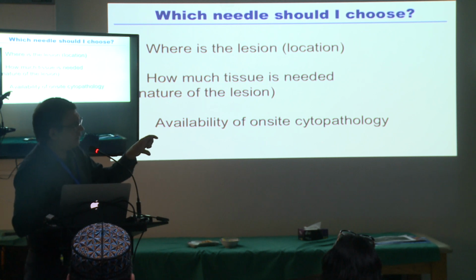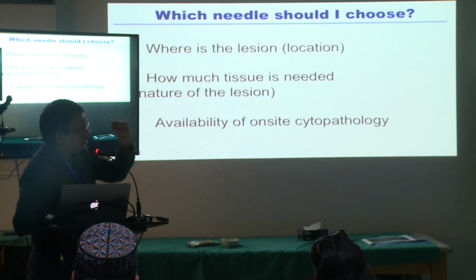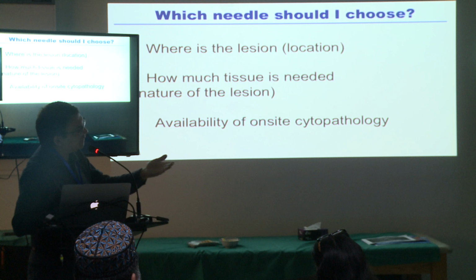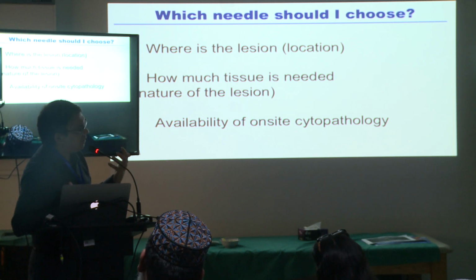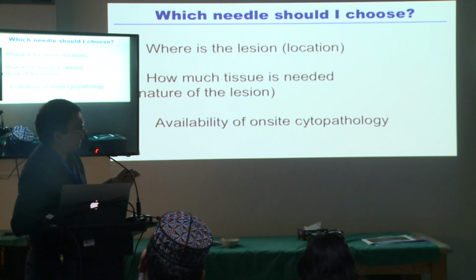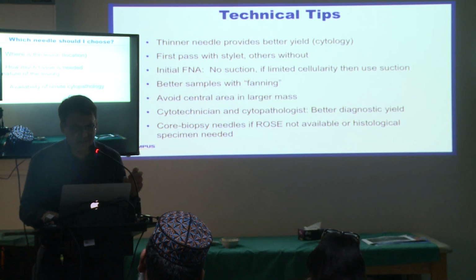What I'm trying to propose is the concept that when you do a core once, twice, if you do more than 3 times, you will possibly get more tissue in there, but you're breaking the fragment which is already in there by putting more pressure on it. So for liver, it's squeezing it. For liver biopsy, really 2, 3 at the most. I don't want to go beyond 3, because that's going to break the tissue by compressing the tissue inside the needle. Okay? So I pretty much talked about that already.